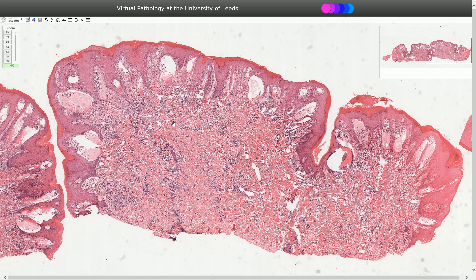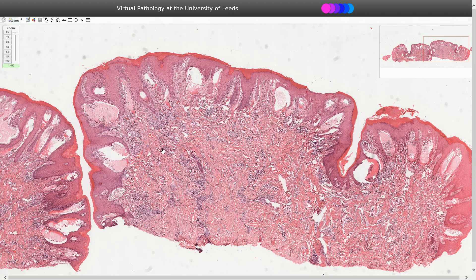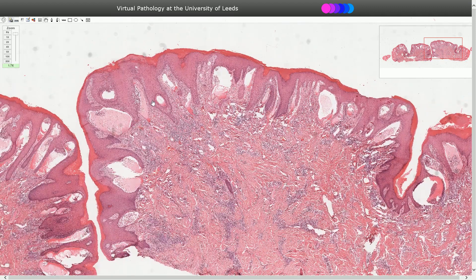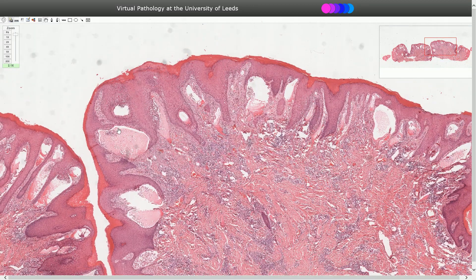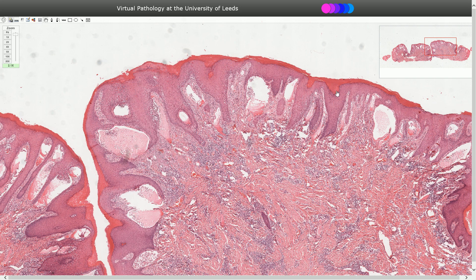Here we have another case of angiokeratoma which is associated with chronic lymphoplasmacytic infiltration in the dermis. Again we can see the characteristic signs of ectatic dilated blood vessels herniating into the epidermis, plus reactive epidermal changes with acanthosis, hyperkeratosis, and elongation of rete ridges around the ectatic blood vessels. This is angiokeratoma.